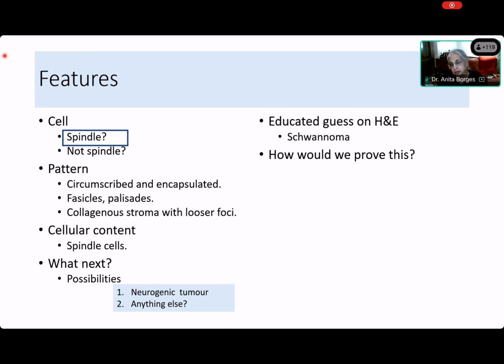So how are we going to prove this? Come on, do you have any other differential diagnosis, Saida? Yes, ma'am. Malignant peripheral nerve sheath tumor. Really? You thought that this was a malignant peripheral nerve sheath tumor, Saida? Why did you say schwannoma? Do you think this was malignant? How would you make a diagnosis of malignant peripheral nerve sheath tumor? What do you require for that diagnosis?